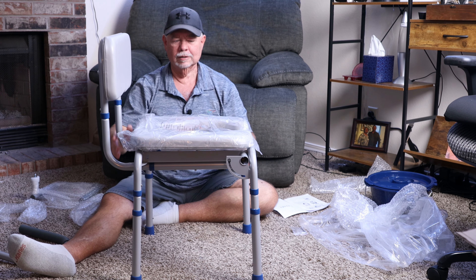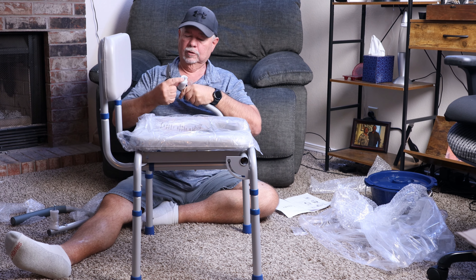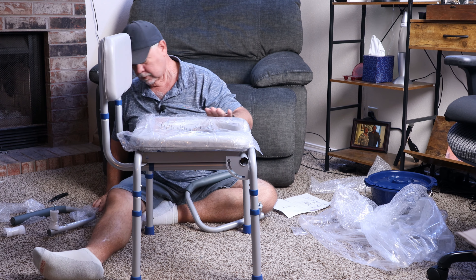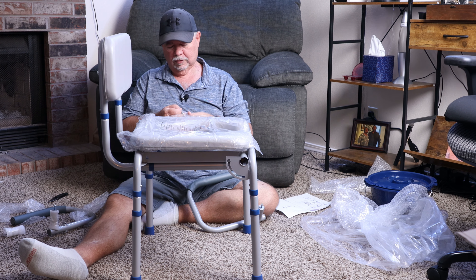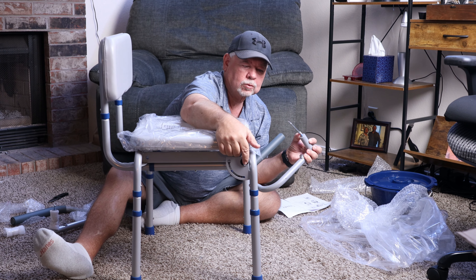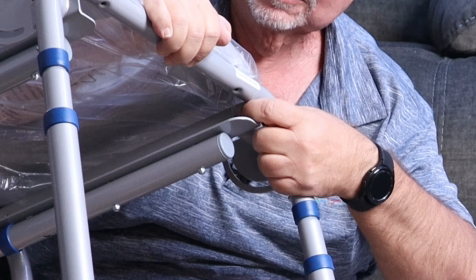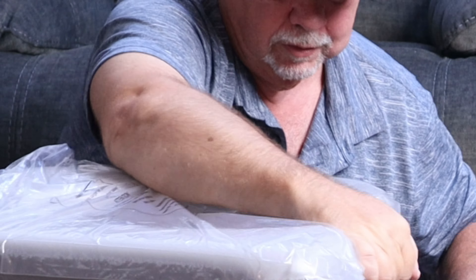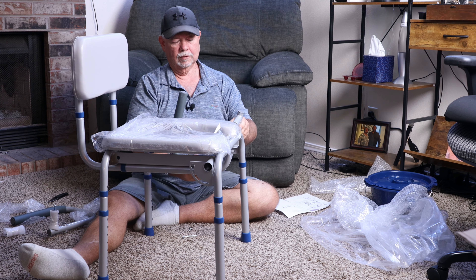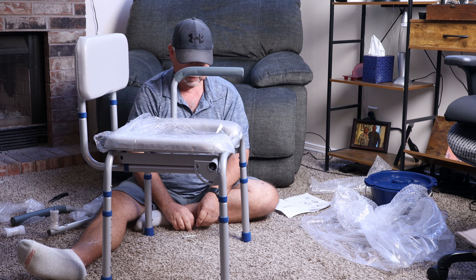We have most of it put together already. Now we have these pieces here, which will be your armrests. Looks like this is where we're going to use our Allen wrench — there's a little Allen screw in the end right here. Take your Allen wrench and take the screw out of the armrest. We're going to shove it in the hole right here on the back side — right up in here is where it'll go in — and screw back into your armrest. There's a washer on there, so don't lose your washer. There's a push pin right here that will let you turn it up and down.